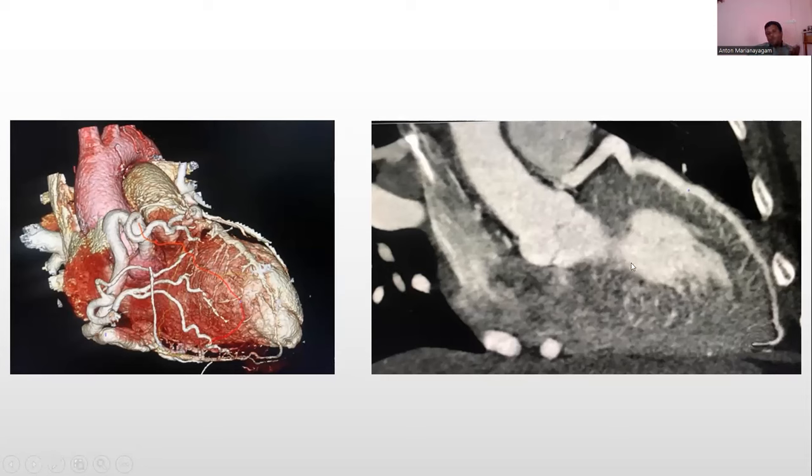So during the 20s, during the 30s, these patients also will develop ischemia and these patients will be developing arrhythmias as well. You see these tiny, these are the collateral vessels. These are the collateral vessels supplying, they are supplying blood from the right coronary arteries.